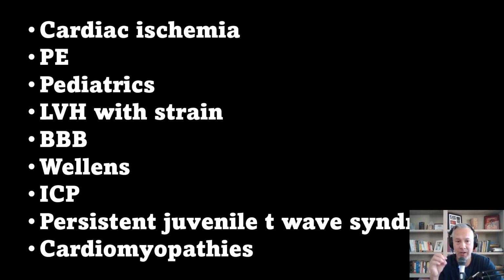These are in very specific anatomical leads that look at a very specific area of the heart, and this could indicate that the heart is ischemic. We're not going to activate the cath lab on inverted T waves, but we're going to sit up and pay attention. This is a red flag that something is awry, and we're going to get serial EKGs.